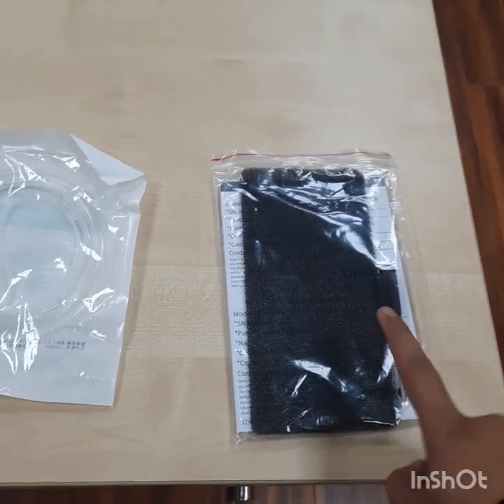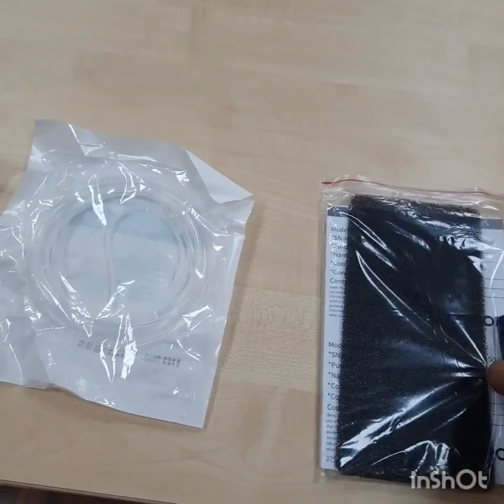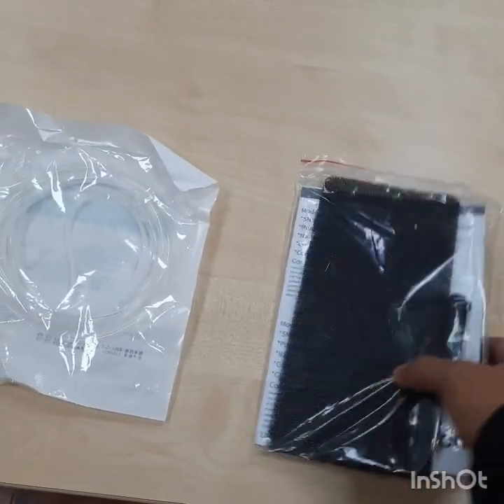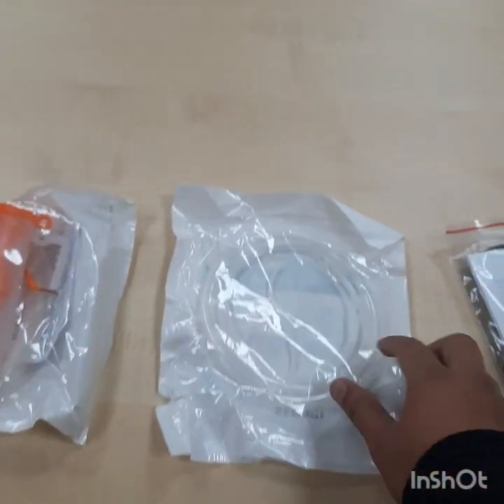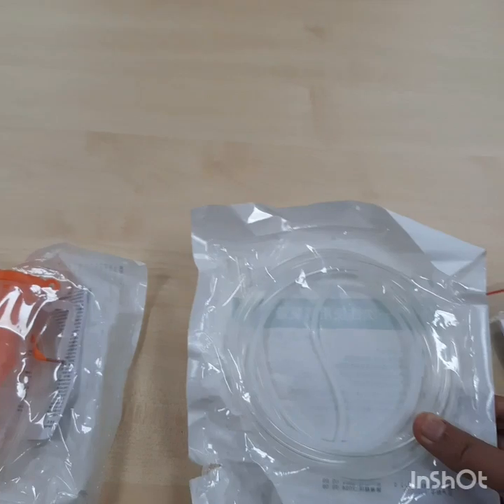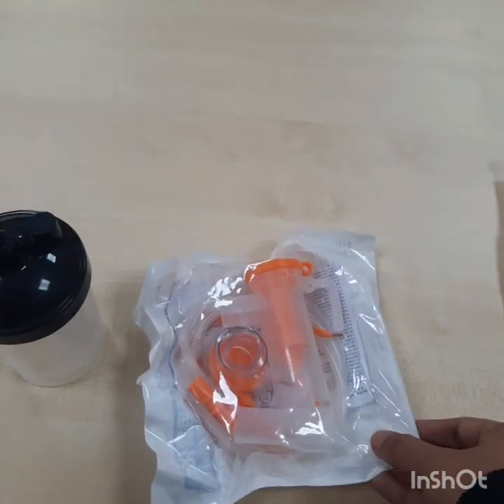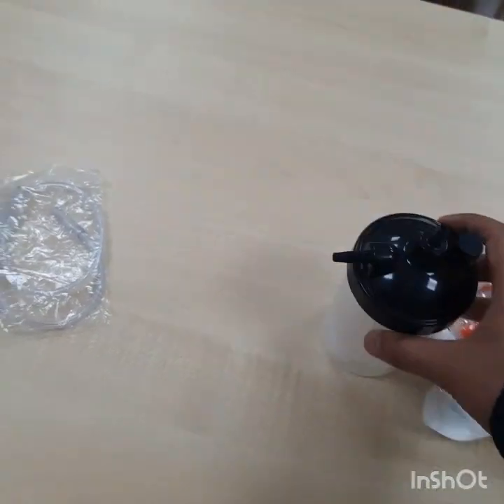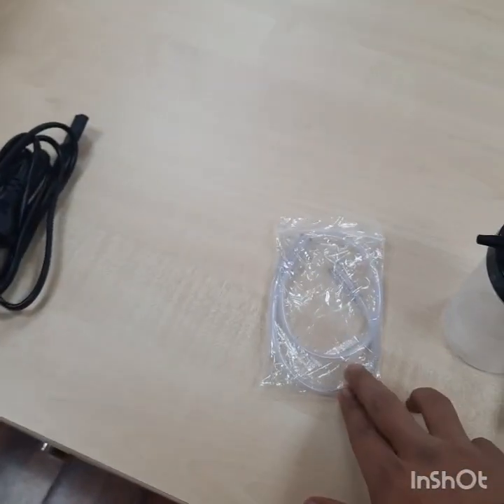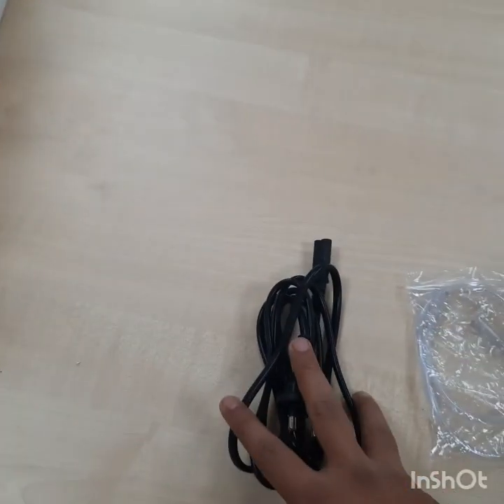Otherwise, the output oxygen may be contaminated, causing injury or physical discomfort. In the accessory box, you will get an instruction manual, primary filter, screwdriver, and two fuses. Also included are an Air Cannula, Oxygen Cannula, Nebulization Set, Humidification Bottle, Oxygen Tube, and Power Cord.